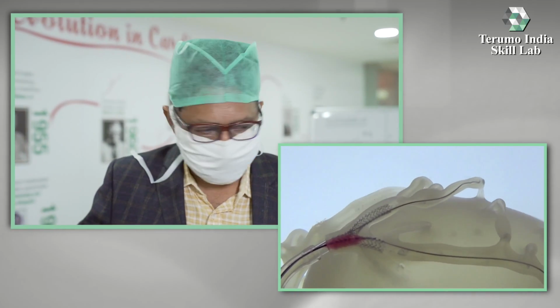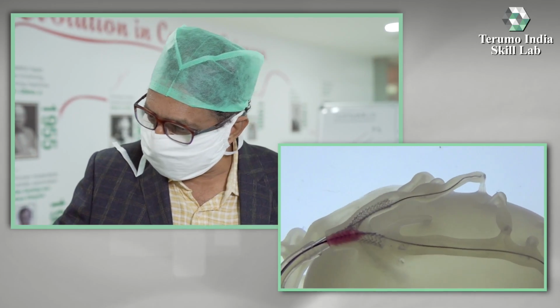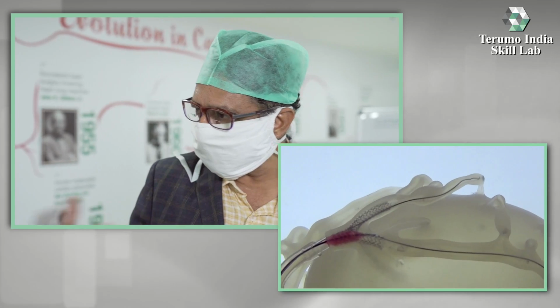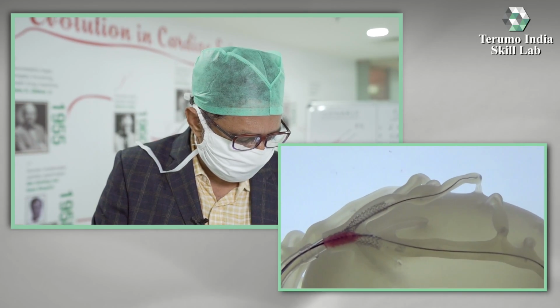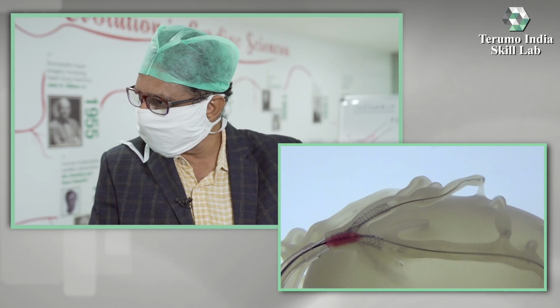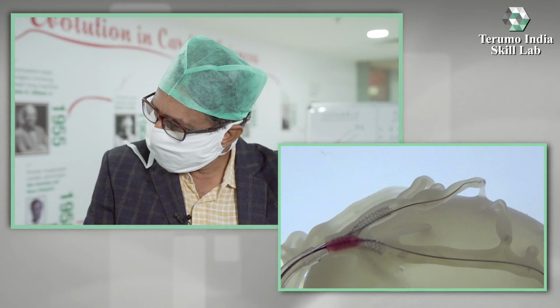The entire disposition of both the stents should be with the outlook that the carina should be metal free. Carina should have minimal metal, because if you clump the metal at the carina, then the chance of recurrence, ISR, is higher. So now this is what you see, that the marker is just at the carina and the shoulder of the balloon is beyond the carina, so that you have full expansion just prior to the carina.